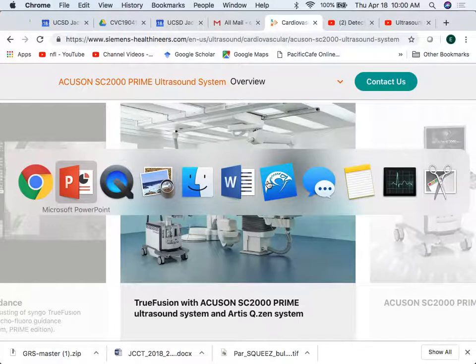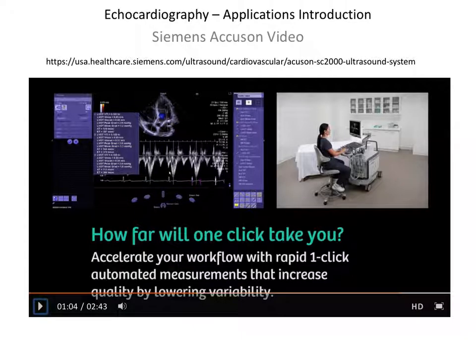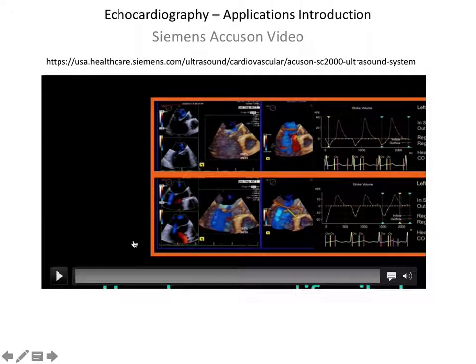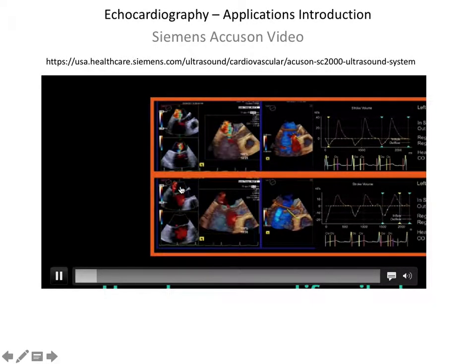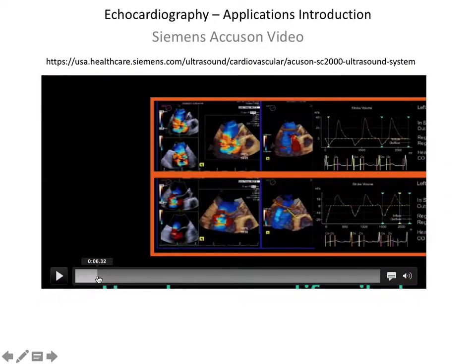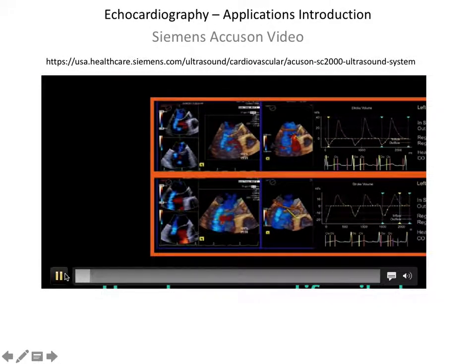Let's go back to this. And so here we see two-dimensional echo images. This looks like a mitral valve again. And on this side we see three-dimensional images. And I don't know if the movie, oh, the movie's in here, good. So you can see the Doppler signal through the mitral valve. Sorry about that. This is like marketing material. But it's beautiful data. And yeah, let me go back here and pause it.